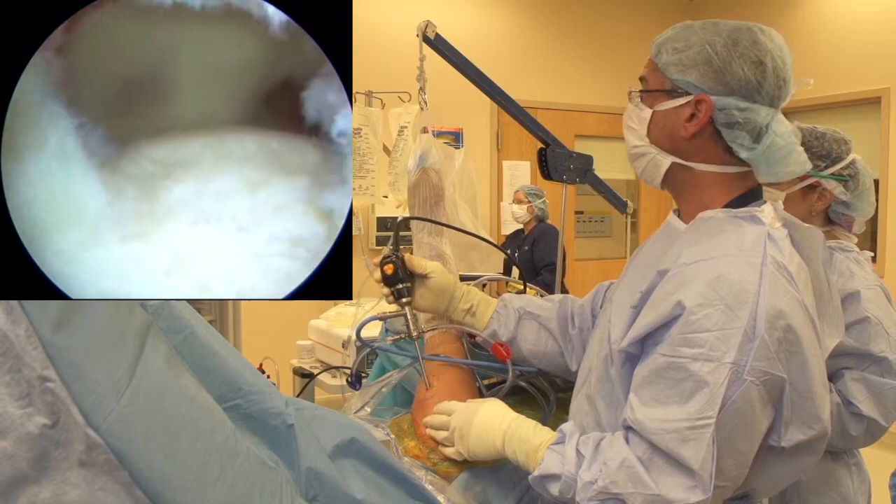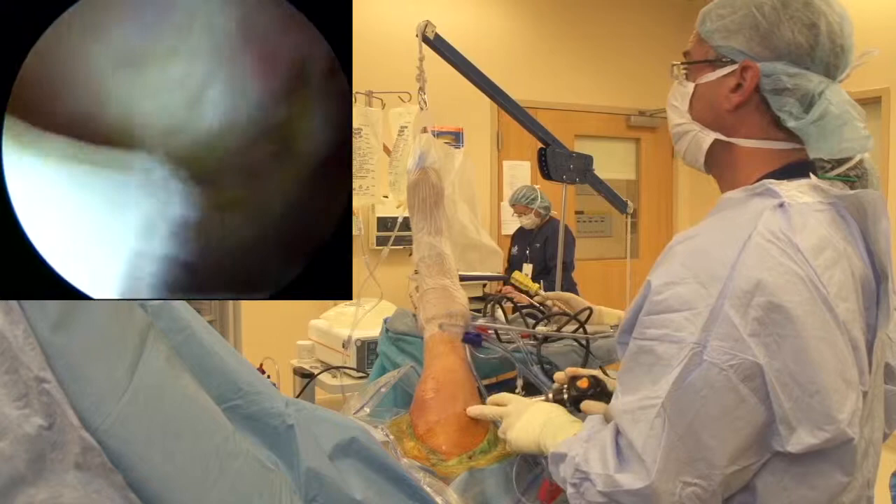At this point we can go ahead and start our technique for nanofracture, and then we'll come back and look at the bleeding bone as well. So I'm going to go back into my posterior viewing portal.